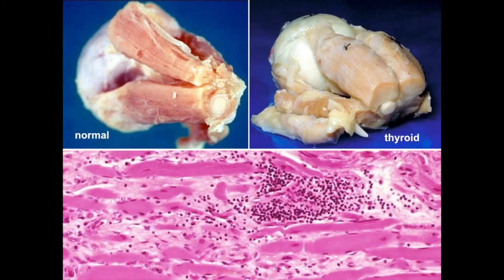The gross photographs above compare the extraocular muscles of a normal eye with the massively enlarged muscles of our patient with thyroid optic neuropathy. Note that the photo of the normal eye is somewhat enlarged compared to the eye with thyroid disease. The swollen bellies of the extraocular muscles compress the optic nerve in the eye with Graves' disease. Histopathology of the muscle shows endomysial fibrosis with glycosaminoglycan deposition and foci of lymphocytic infiltration.